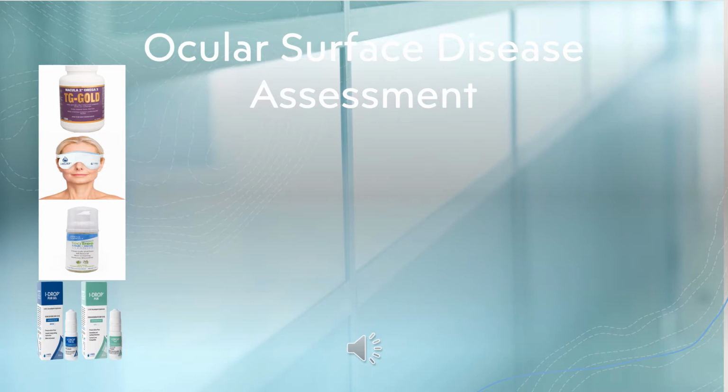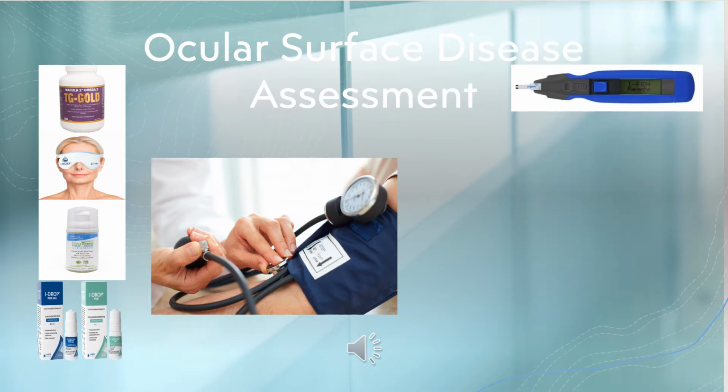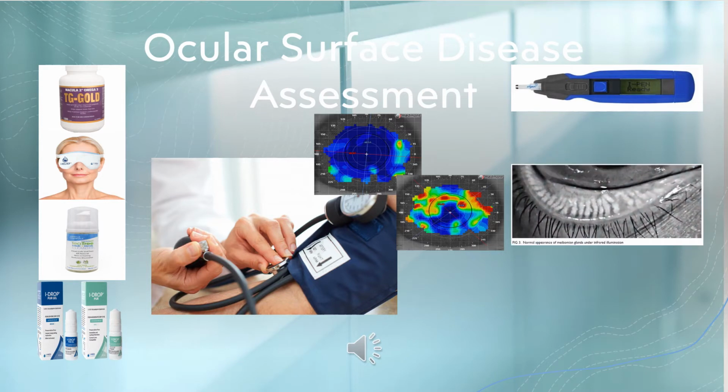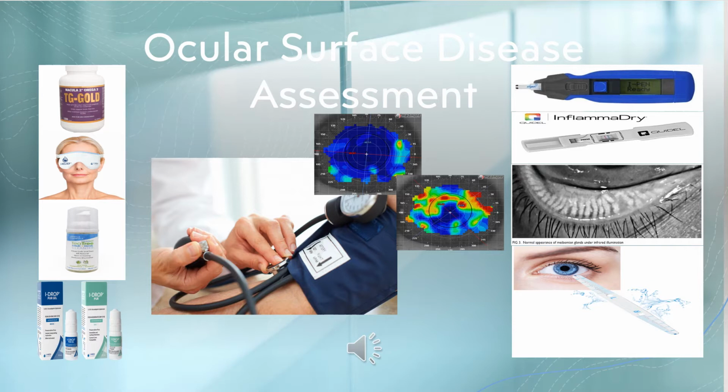Similar to having your blood pressure checked or your blood sugar checked, your family physician will want to know what the initial readings are, and if they put you on medications, how is it affecting it? In dry eye, we want some data, such as osmolarity, tear breakup time, how many meibomian glands remain functioning, and the quality of the oil. How much water is in your lacrimal gland? How well is it secreting it? Is there inflammation present? These are some of the numbers we basically need.